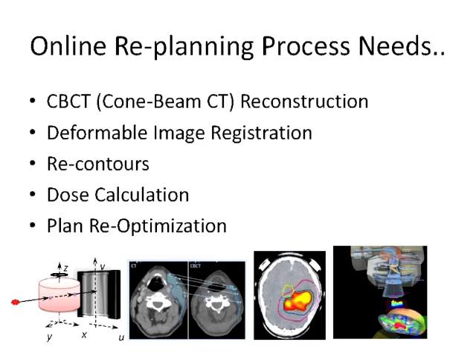And also, the tumor is in a slightly different location. We have to recontour the doctor's plan. The doctor painted the patient's target here before, but the tumor has moved a little because of repositioning. So we have to recontour the tumor on the new image, and then those have to be calculated, and we have to re-optimize for the new tumor positions.